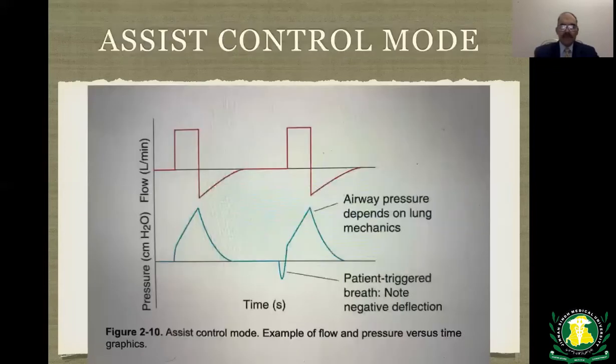This is a schematic presentation of assist control mode. As you can see, the top one is the flow and the bottom is the pressure waveform. The first breath is ventilator delivered, and the second breath is triggered by the patient, as you can see from the negative deflection.